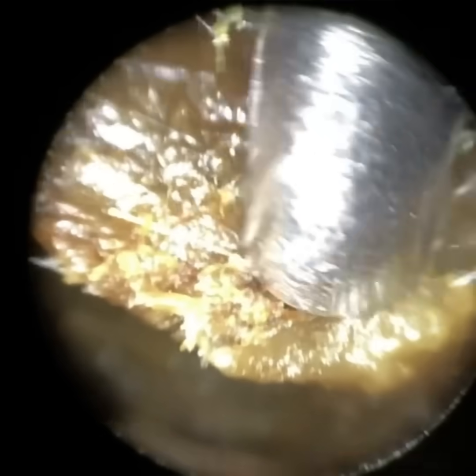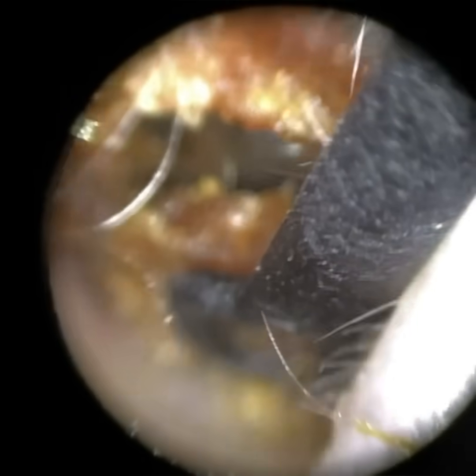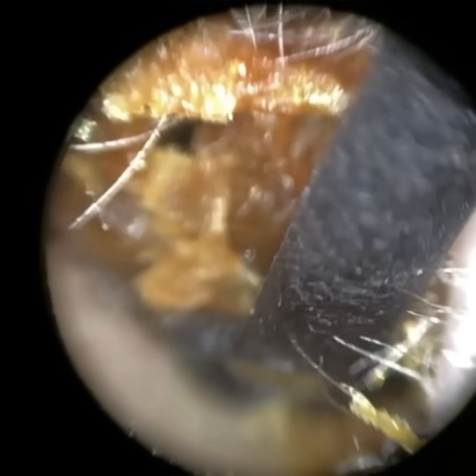I hope you all had a wonderful and Merry Christmas, enjoyed some time off work, and spent time with loved ones. This patient attended with a blocked left ear, and I'm using the WaxScope with our 4.25mm speculum, which is our medium-sized speculum. We've got a smaller size, the 3.5mm, which is the one I actually prefer using the most, because it allows me more manoeuvrability in the ear. I'm able to navigate, stretch and dilate in the ear canal a lot better with it, and a lot of patients who suffer from wax problems have narrow and twisty ears, so 3.5mm is definitely my preferred size.